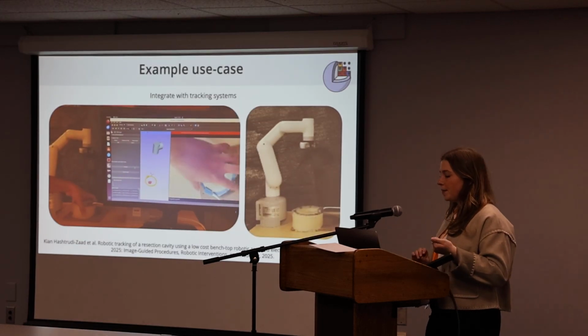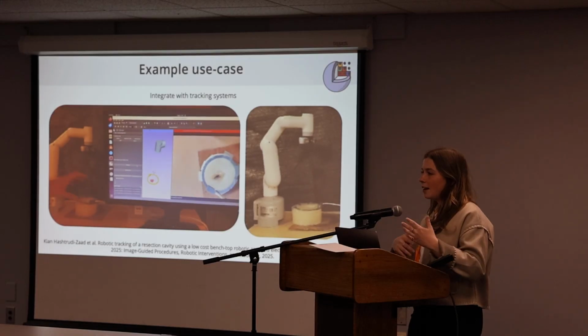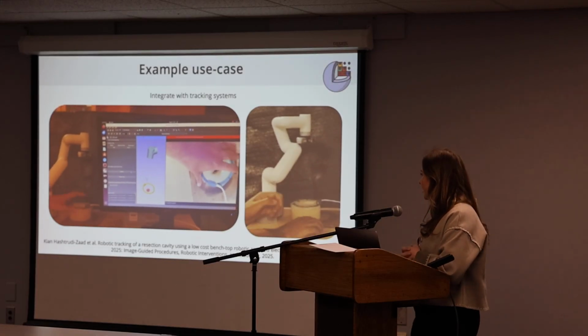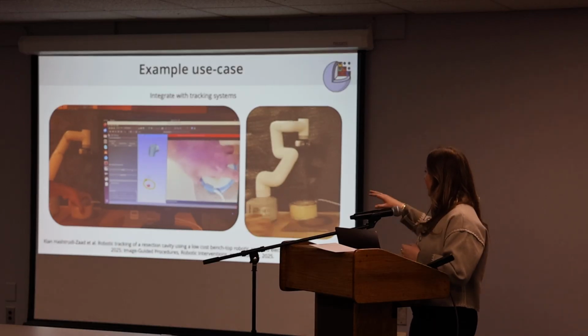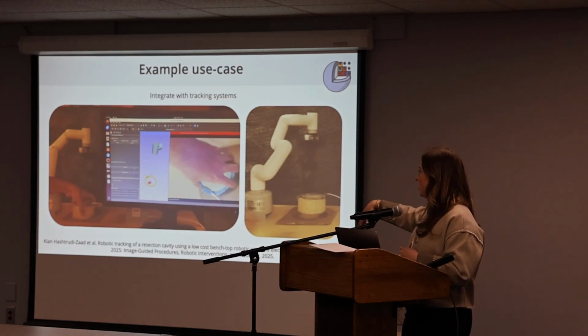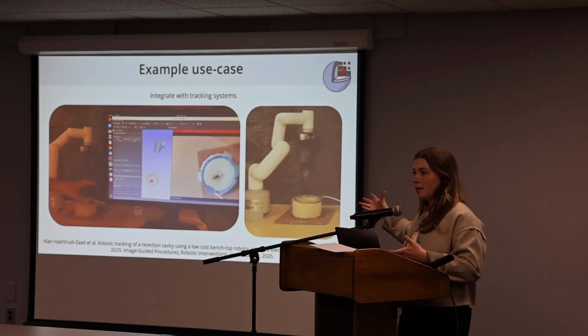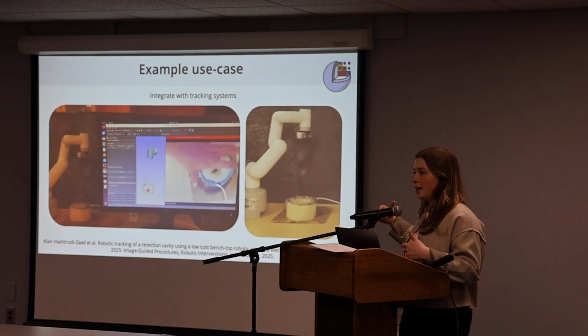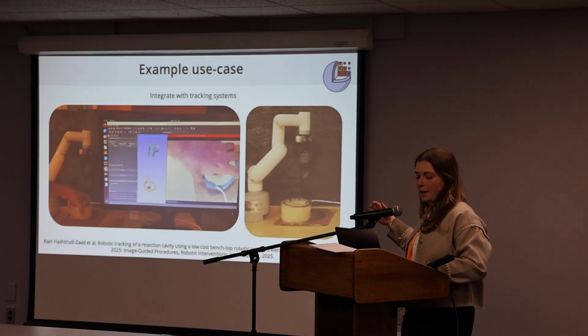It would be useful. In Slicer, there are a lot of navigation systems that are already built on top of it. This is an example of one where we use electromagnetic navigation for breast tracking. Here, there's a little EM sensor in this retractor. The entire navigation system is built on Slicer, so we were really quickly able to add a robot in the loop to follow that retractor based on that tracking data, and Slicer is the common middle ground here.